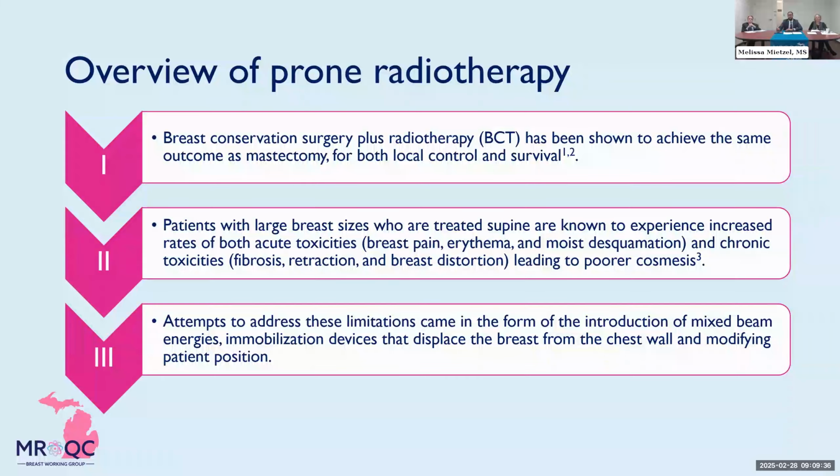Attempts to address these limitations have come in the form of the introduction of mixed energies to the treatment fields, immobilization devices that displace the breast from the chest wall, as well as modifying the patient treatment position. And we're going to be focusing on the latter of these two a little bit further.